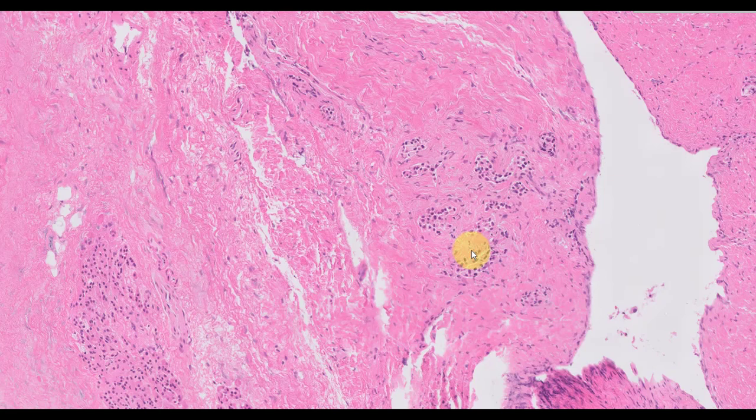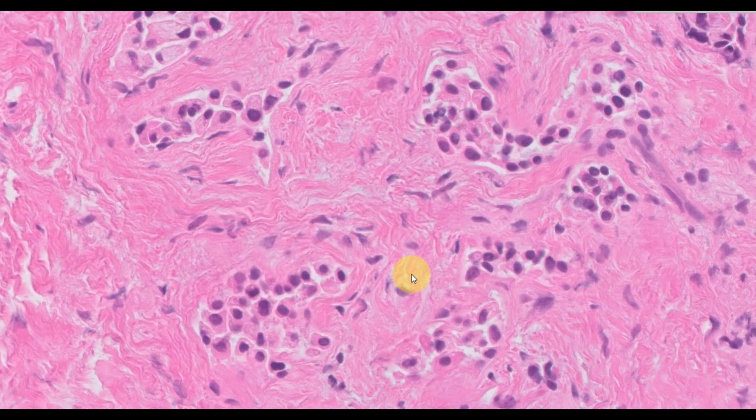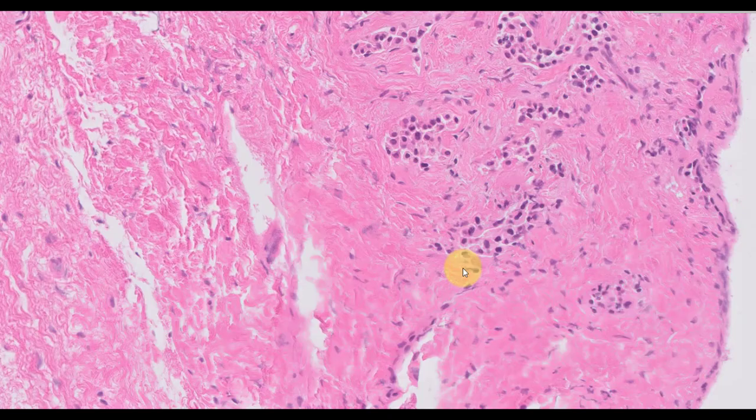Why do I think this is not cancer? For one, it's confined to the immediate area around the main pancreatic duct. It's not spreading anywhere outside that zone around the main pancreatic duct. It's very monotonous. It's unusual to see monotonous cancer like this. The architecture is wrong. There were not any of those angulated glands.